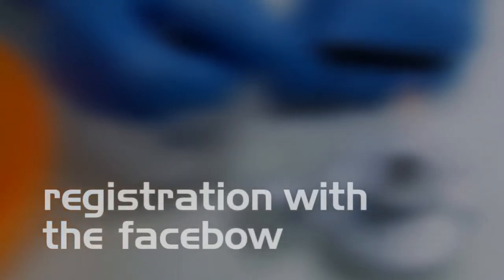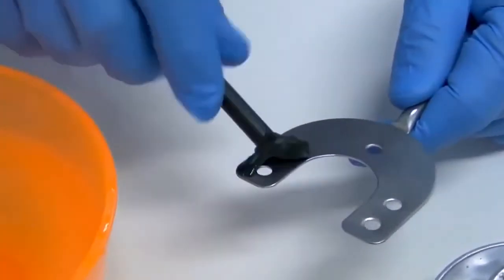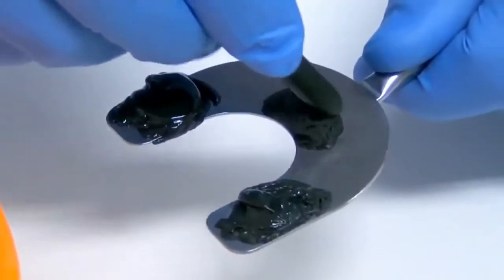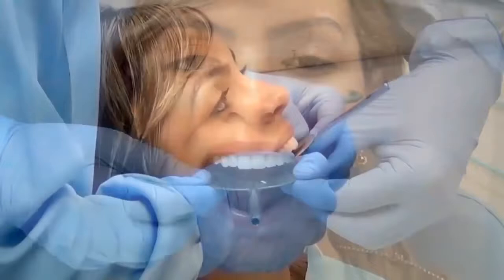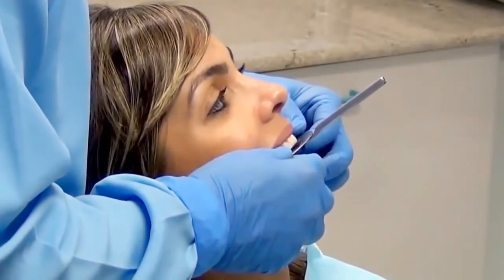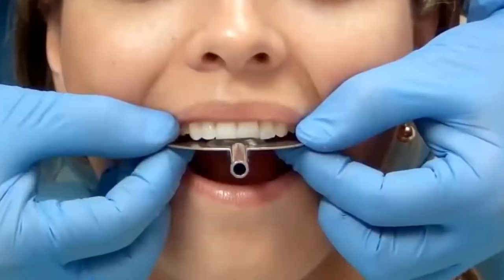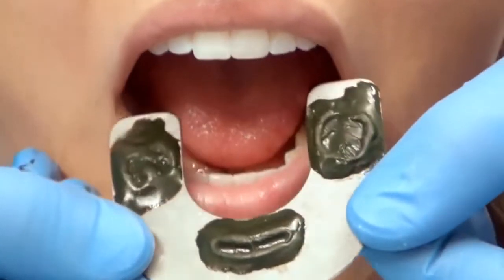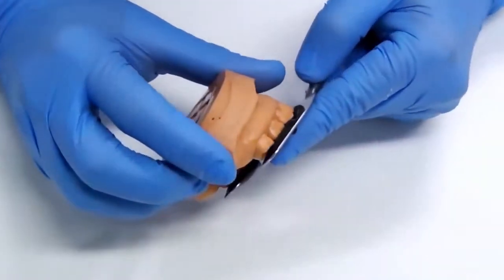With the face bow, by using registration material, determine three points on the fork for the dental patient: two in the posterior area in each of the semi-arches of the fork and one in the anterior area. Align the fork handle with the facial midline of the patient and place it on the upper teeth, holding it until the material hardens. Try the plaster cast on the registration to confirm its stability.